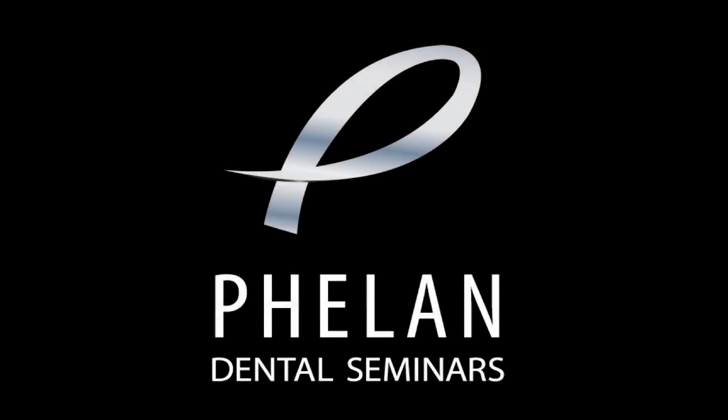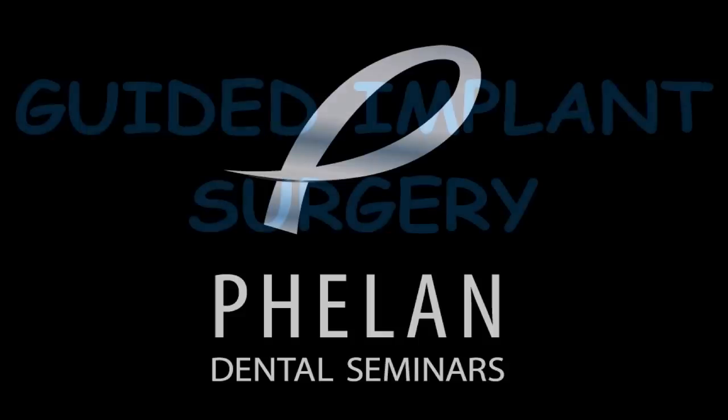Here's the keynote for guided implant surgery. I'm very excited about this technique — I think it's very beneficial to the patient and it makes the surgical part of the appointment very simplified for us. As long as you've done your pre-treatment implant planning properly with the Simplant software or whatever guided software you're going to use, and you have a good CBCT cone beam volumetric tomography image for the patient, the whole case will go very smoothly.